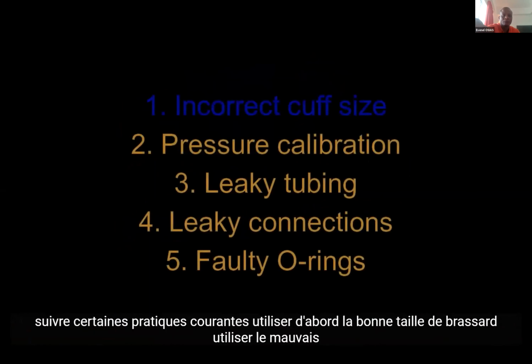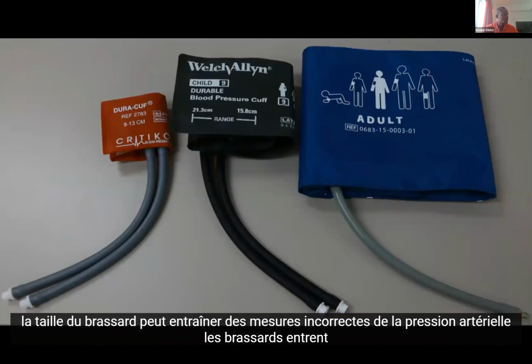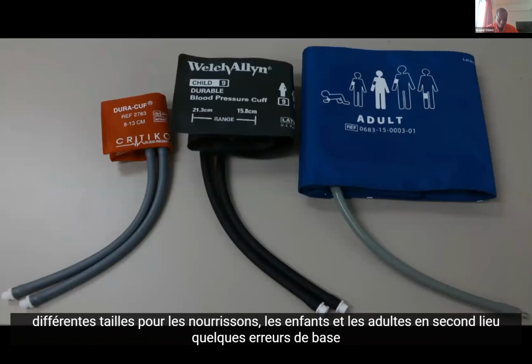First, use the proper cuff size. Use of the wrong cuff size can result in incorrect blood pressure measurements. Cuffs come in different sizes for infants, children, and adults.